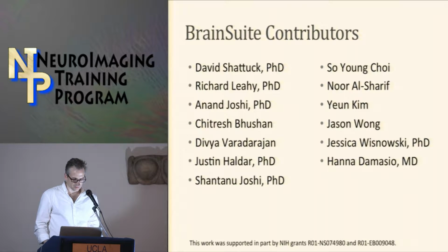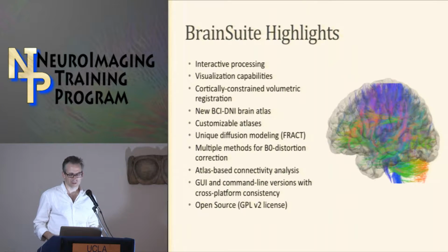I wanted to describe some of the highlights about BrainSuite, to get at the question of why you might want to use it, because there are obviously a number of other terrific tools out there, and you may have your own preferences. But the main benefits that our users often report to us are that it has a lot of flexibility for performing interactive processing, and a lot of powerful visualization capabilities.